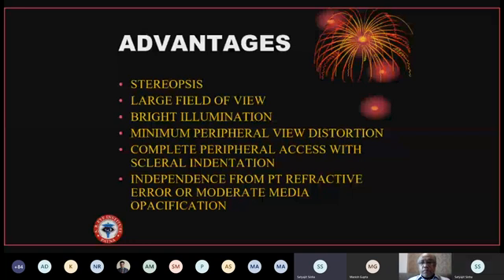Whenever I don't use a direct ophthalmoscope, I use a 90D through my slit lamp. But for each and every cataract surgery, it is an absolute must that the fundus should be examined in detail, which is why I send all patients compulsorily to Dr. Pooja Sinha for a complete retinal examination, and only then do we undertake all the different preoperative tests before doing the actual cataract surgery. I thank you so much for enlisting it so nicely.